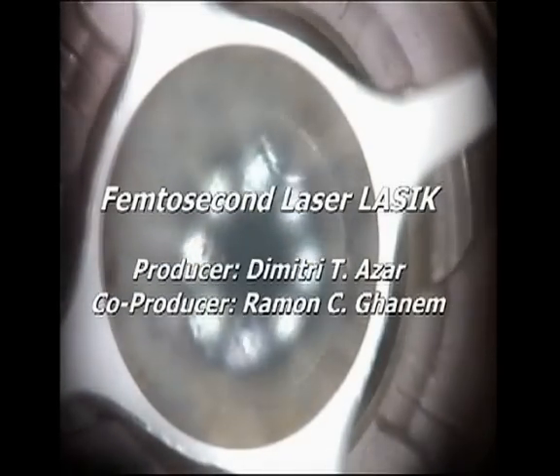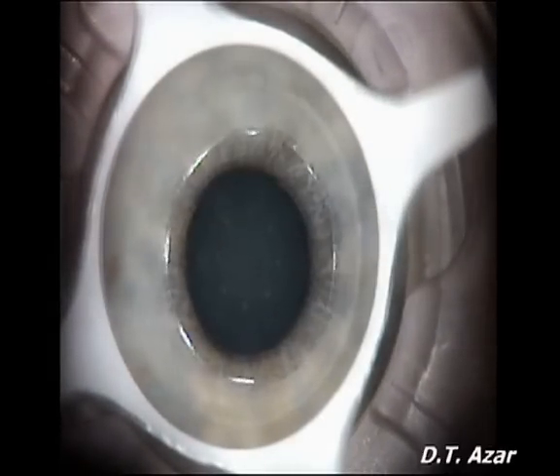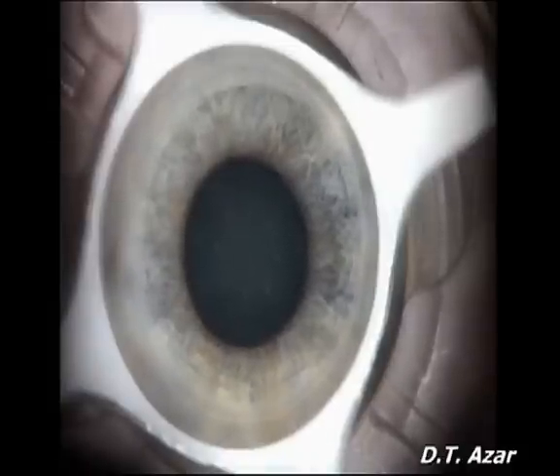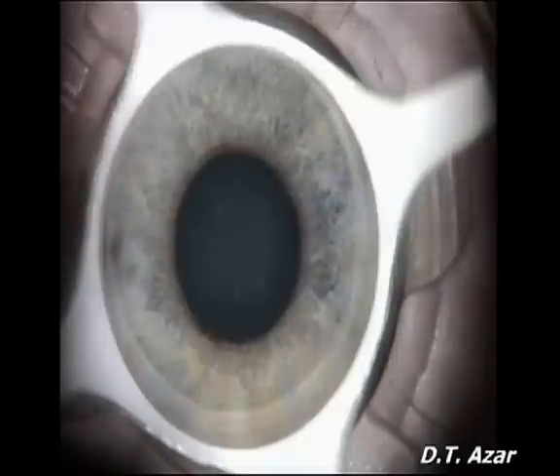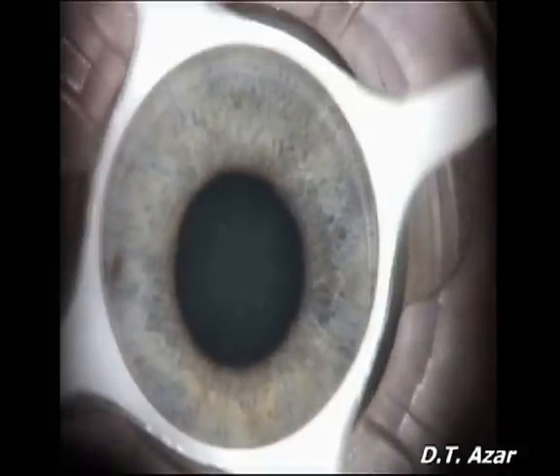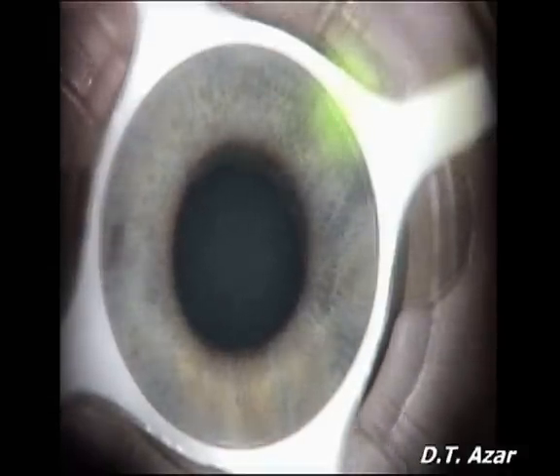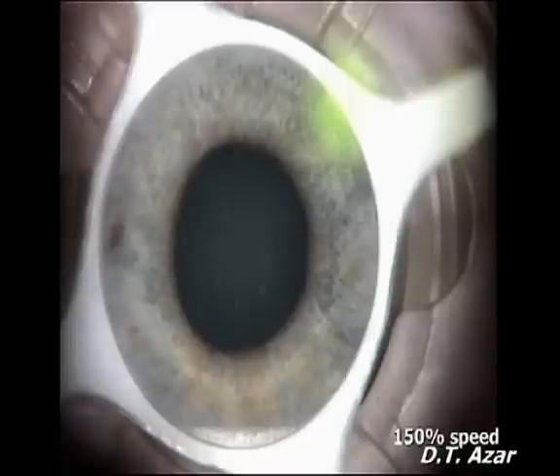This video demonstrates a femtosecond laser-assisted LASIK procedure. After placement of a low-pressure suction ring to align and stabilize the globe, a flat contact lens attached to the laser system is used to applanate the cornea. Appropriate positioning is assured.